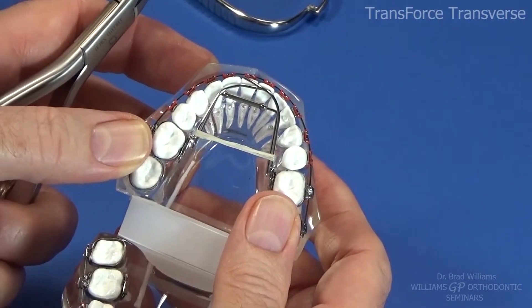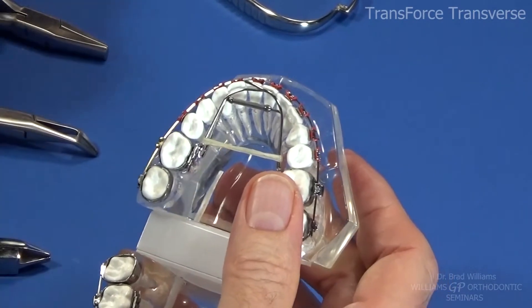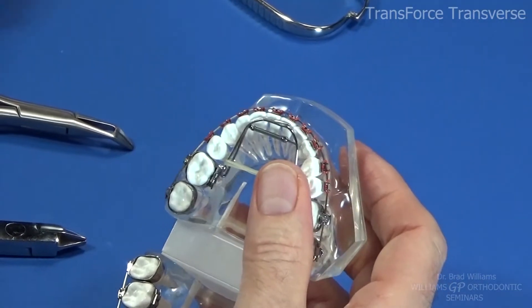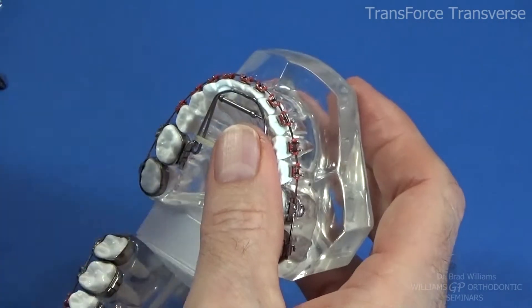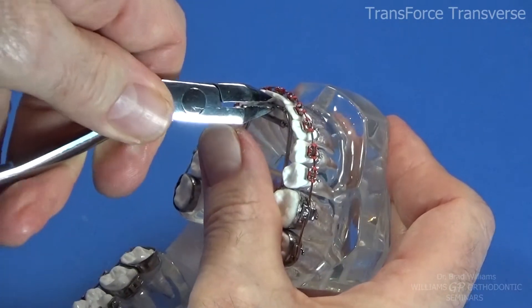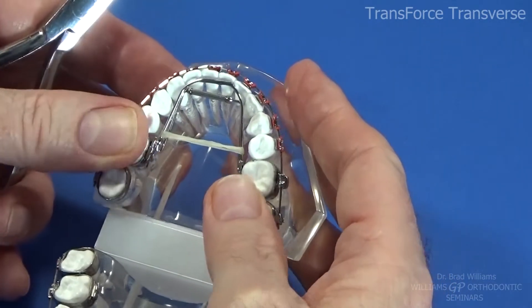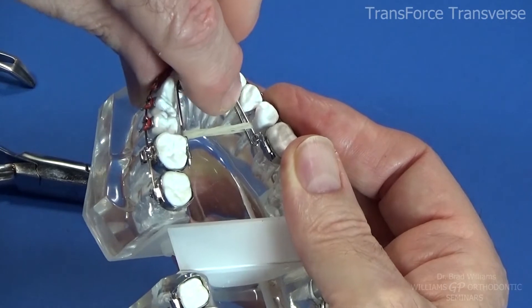Look at where our arms are — we need to make adjustments. You may be adept enough to make these adjustments in the mouth, but it's certainly easier on the typodont. I'm using a holochop here to change the arm position. You could use any tool in your bag — a Weingart or a three prong. Normally I would not do this in the mouth. I would make marks on the arms where necessary and then bend them outside the mouth. You can also cut these arms off all the way back in the welded area if needed.